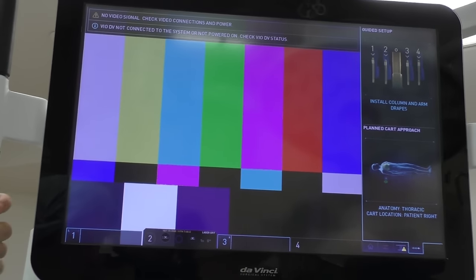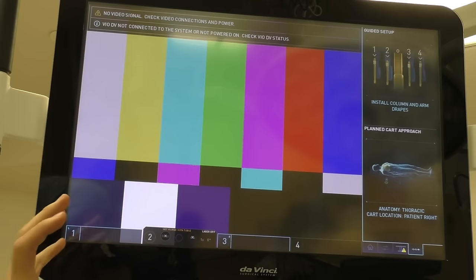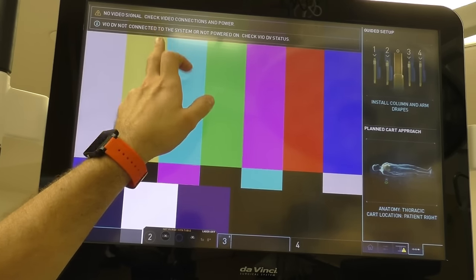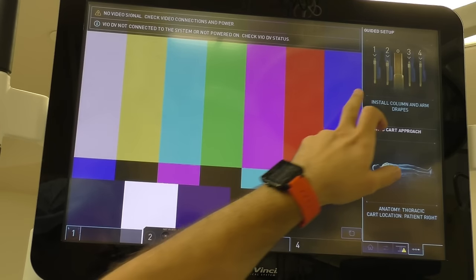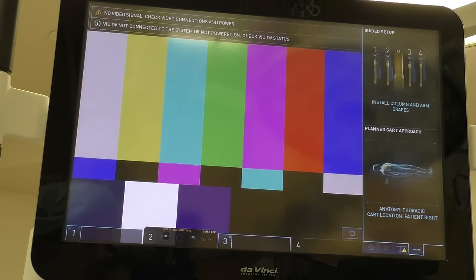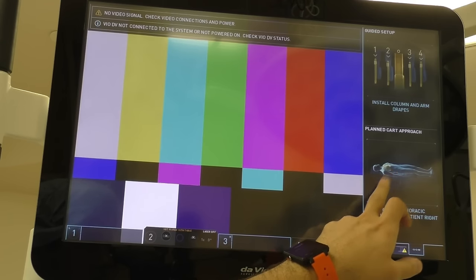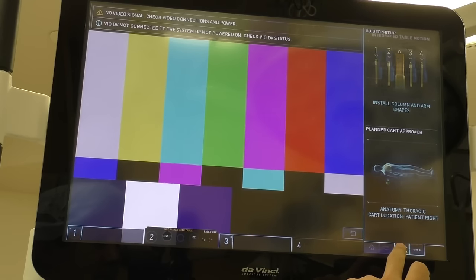If there are any issues that happen during a case or issues with an arm, a fault will come up on the top of the screen and it'll tell you exactly what the fault is and how to fix it. Over here we have our list of all the arms that are connected to the DaVinci itself, along with the planned cart approach — I still have the thoracic right upper thoracic case set up in the menus here.